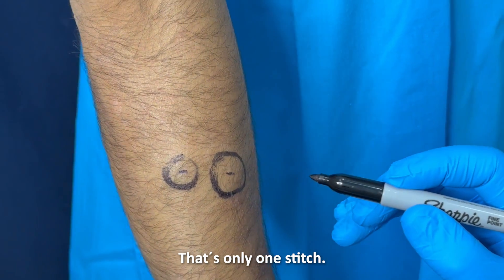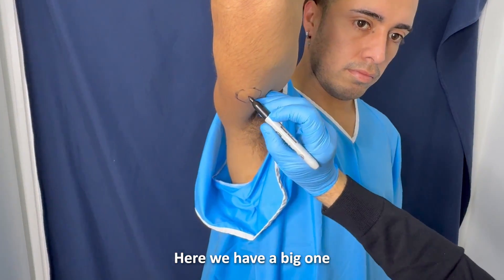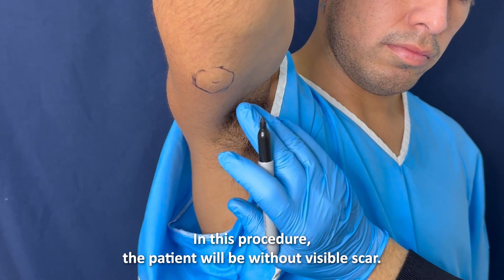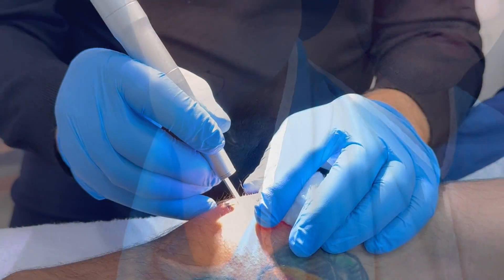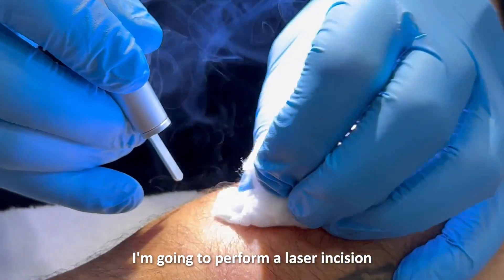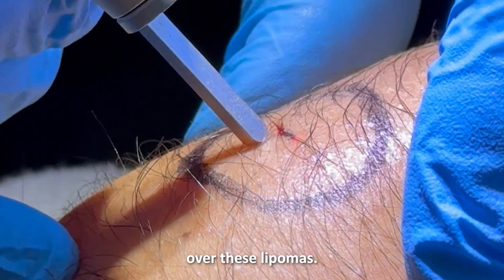That's only one stitch. Here we have a big one. With this procedure, the patient will be without a visible scar. We are going to perform a laser incision over these lipomas.